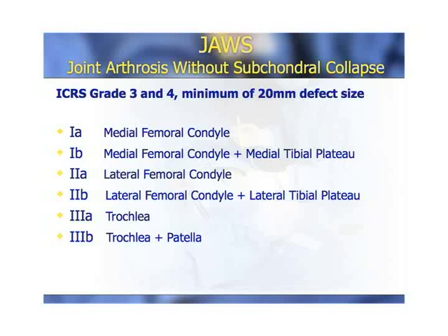I've come up with a classification scheme to categorize these patients that don't have collapse on their Rosenberg views. This scheme has not been validated, but it helps me in my practice as I'm looking at these patients to try to identify who is going to do well and who's not going to do well, because not everyone's going to have tibial involvement. In fact, what I've observed is that the majority of these patients, if you're getting them early, are going to have more involvement on the condyle than the tibia. So if there's no tibial involvement, then as a clinician, I'm put in a scenario where I'm going to use this in an off-label fashion, because I'm not using the tibial implant, because I do not feel the pathology justifies putting a poly on the tibia when there's nothing there. So I've come up with a classification system to reflect this, and it helps me not only track my patients, but it also helps me communicate to my patients preoperatively.